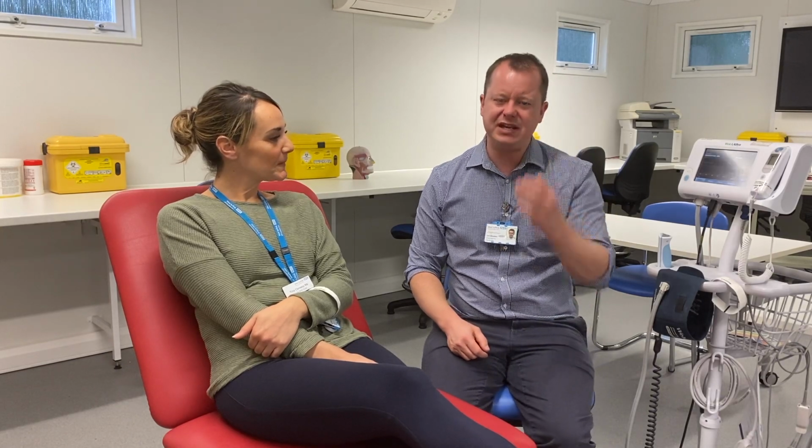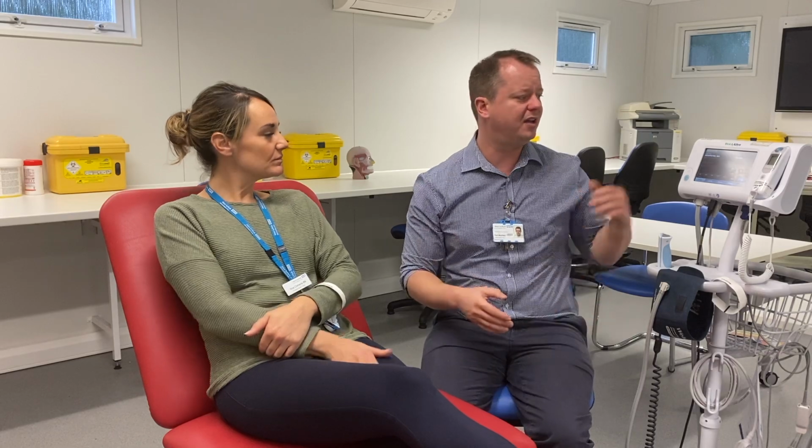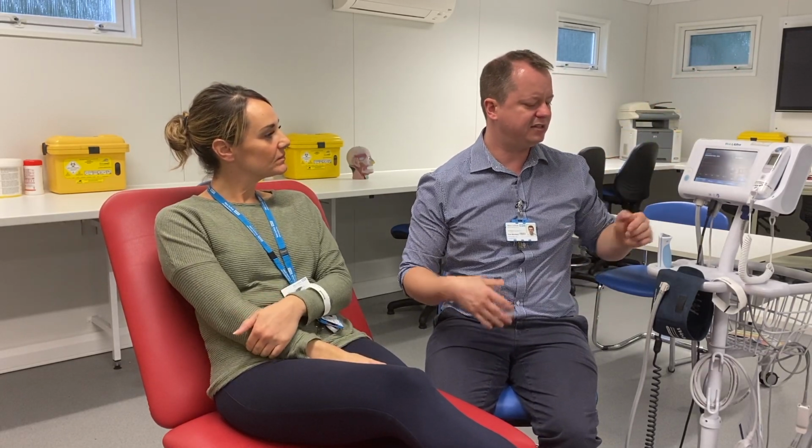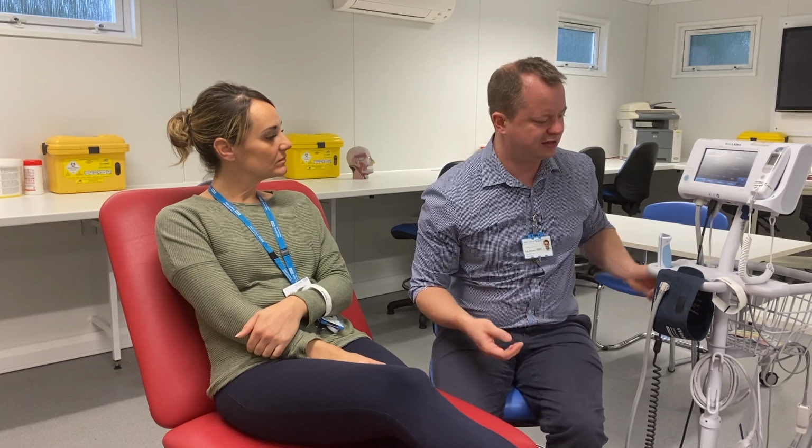Sure, fine. So I've got all the things that I need, and once you've done that, make sure that you identify that this is the person you're meant to be doing this on. So I've scanned this person, so I know this is the correct person here, and I'm going to continue to record the observations that I need to.